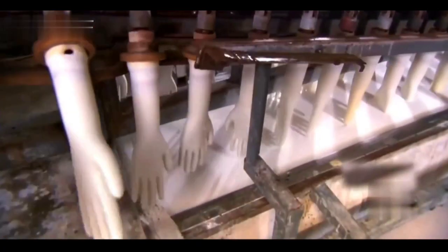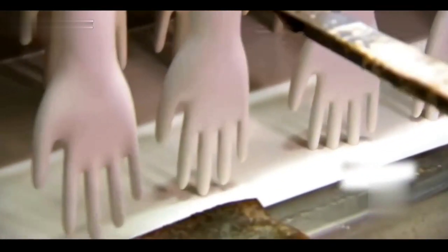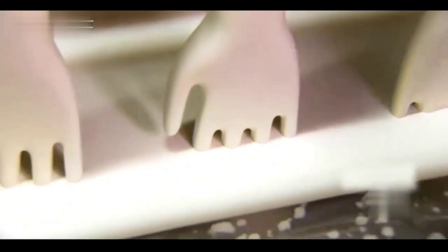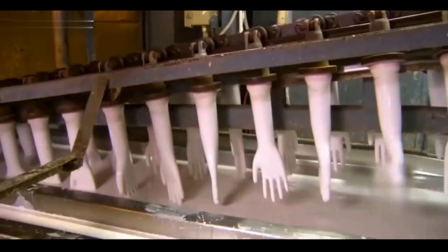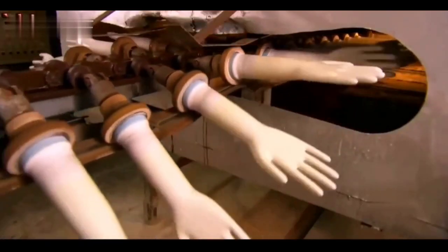Because the latex cannot directly stick to the ceramic surface of the glove mold, it needs to first be coated with a special chemical solvent to form a film, and then covered with white latex liquid. The glove mold goes through 360 degrees of non-stop rotation to shake off the excess coagulation, and is then sent to the airbox.